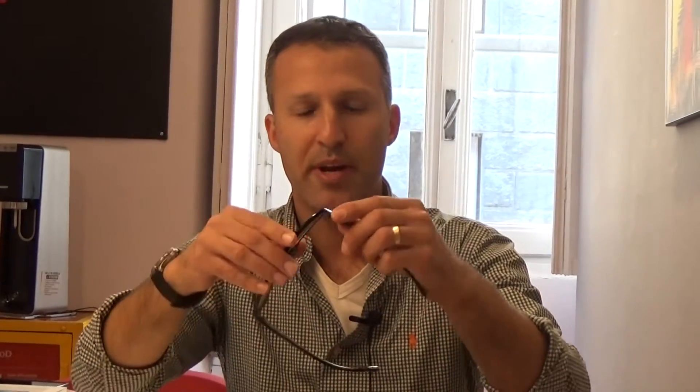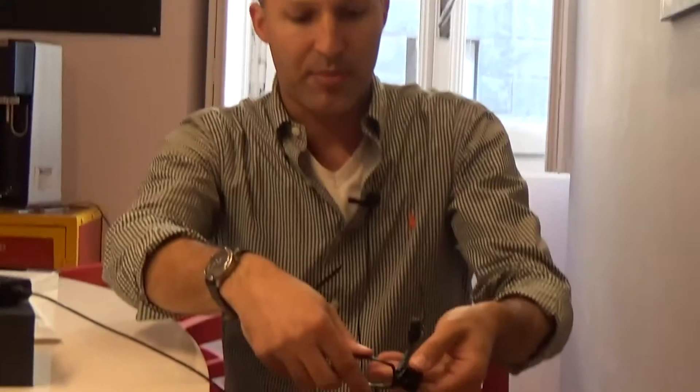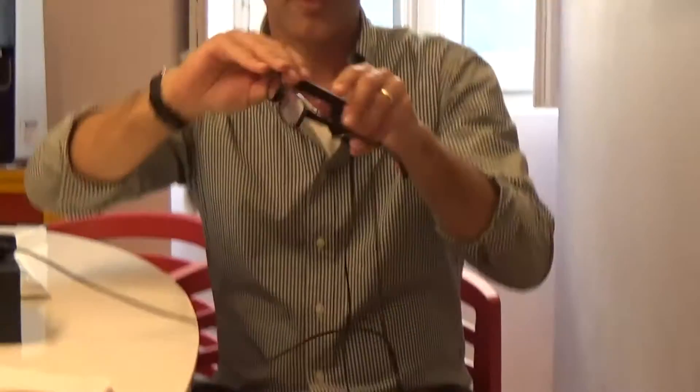You charge OrCam MyEye just like you would your phone — plug it into the wall. OrCam MyEye is a wearable device, and the most natural way to wear OrCam is on a pair of glasses. OrCam MyEye connects to almost any pair of sunglasses or eyeglasses. I just take the head unit, snap it on like that, and then put the glasses on.